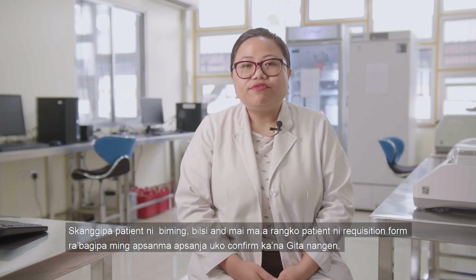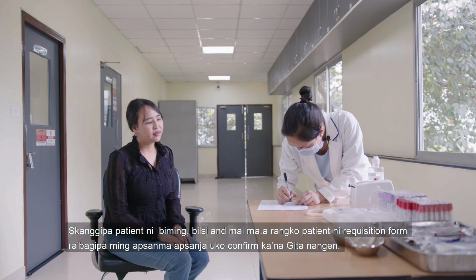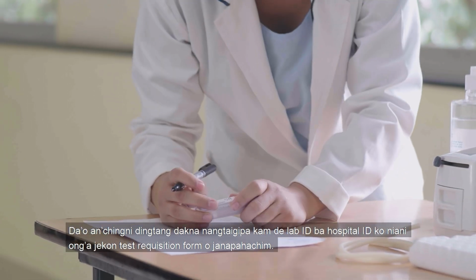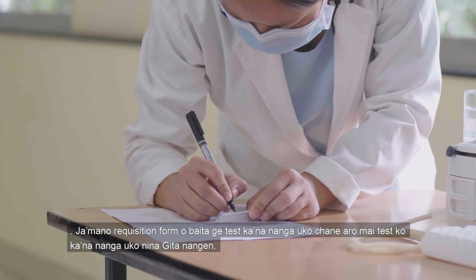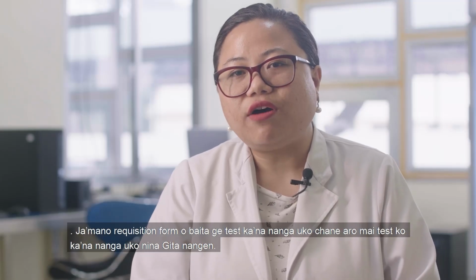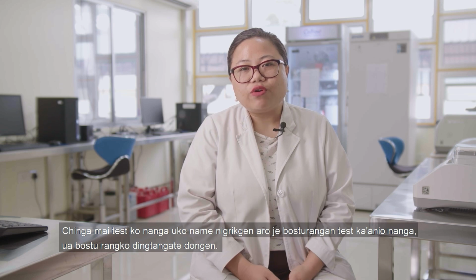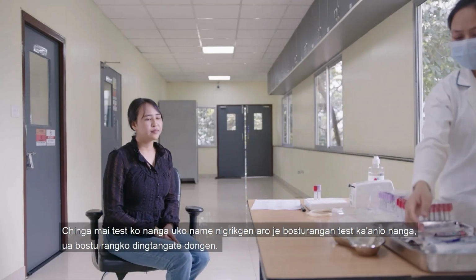Certain points need to be kept in mind when we go through a patient's test requisition form. First of all, we have to confirm the name, age and gender of the patient with the requisition form that comes along with the patient. The next step, we look at the lab ID or the hospital ID that will be mentioned in the test requisition form. Next, we'll look at the tests that are going to be required, and we're going to count the number of tests present for each requisition form. We're going to map out what tests are required, and we are going to separate the different types of consumables that will be required for each test.